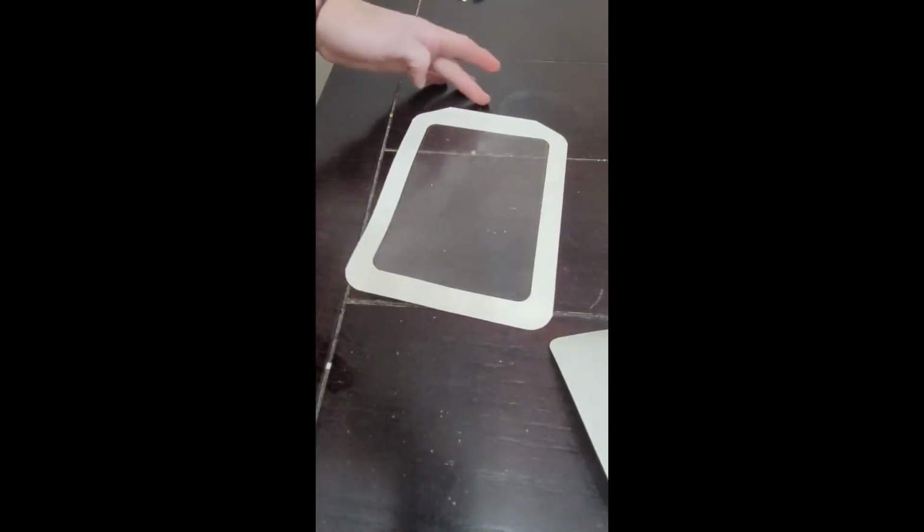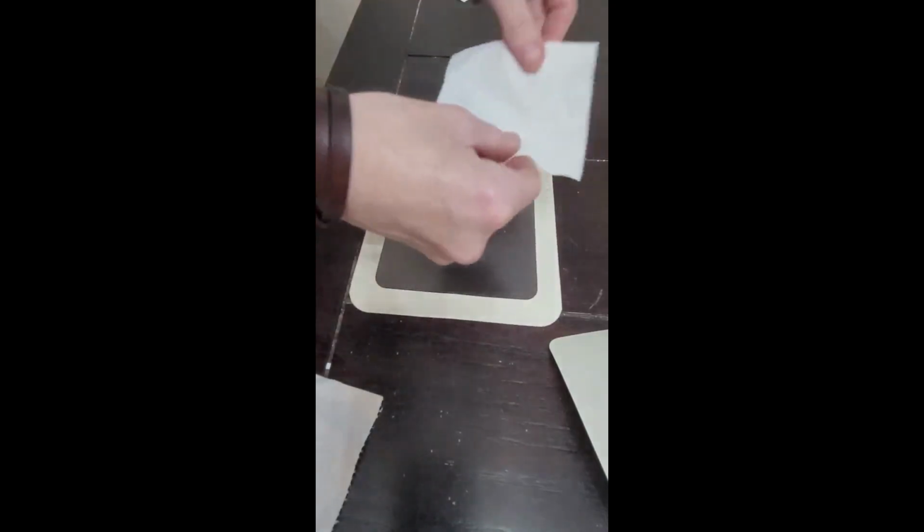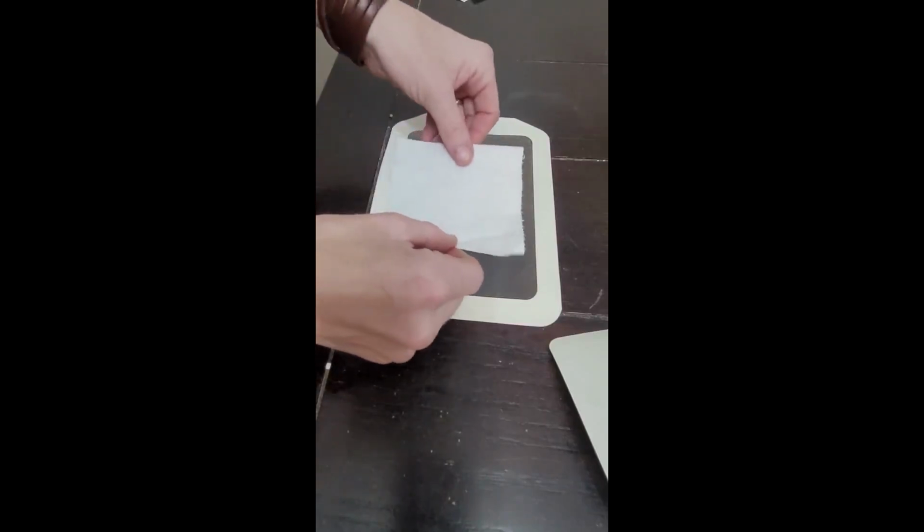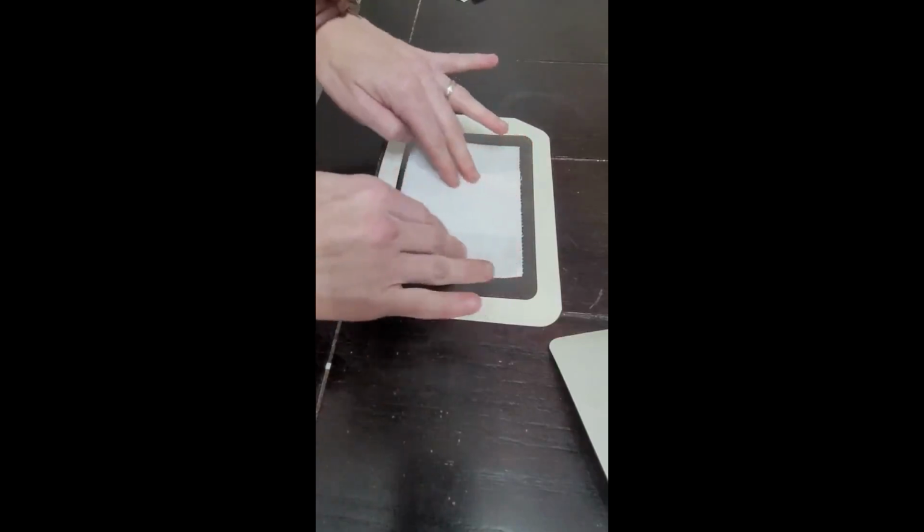Now, what I do with 2 squares of toilet paper is I want to cover that 4 by 6 area of dressing, because if this Tegaderm sticks to it, it's a permanent stick. So I need to make that little area, like kind of the middle of a Band-Aid, that's not going to be adhesive. And this is where I take my 2 squares and I put it in the center, and I estimate. I've been doing this for a long time, so I'm pretty good at estimating what 4 by 6 looks like. And I create that in the center to protect the dressing from sticking and adhering to the Tegaderm. All right, I'm going to flip you back around.